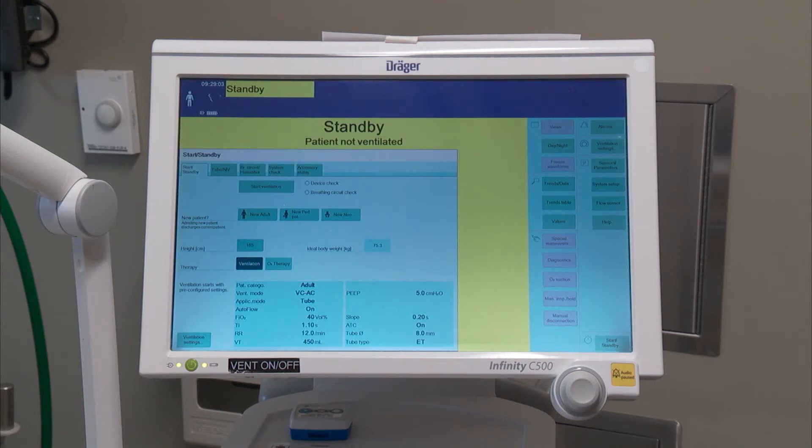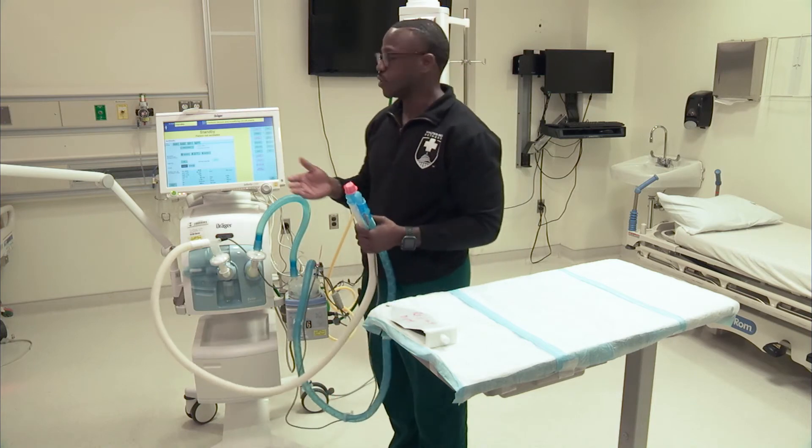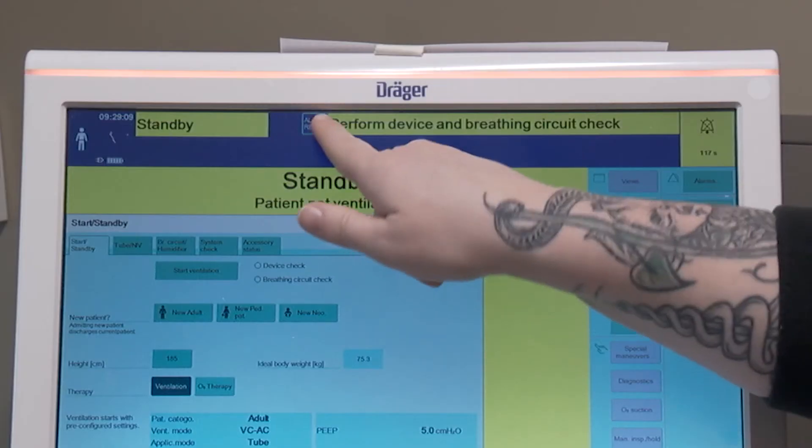That takes us to a secondary screen. A couple of things you want to do — at the top, it says perform a device and breathing circuit check. This will be done before every patient use. But for today's lab, I'm not going to conduct a breathing circuit check. I'm just going to reset the alarm, hit alarm set, reset, and confirm there.